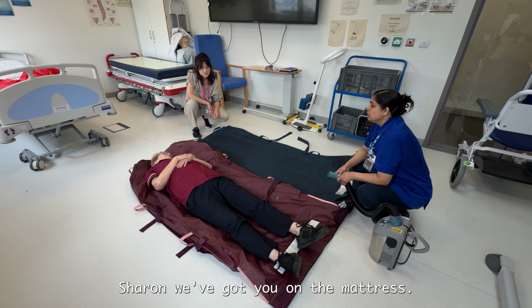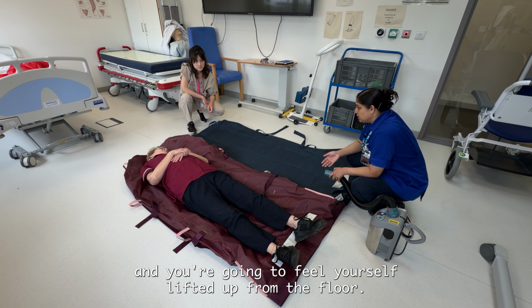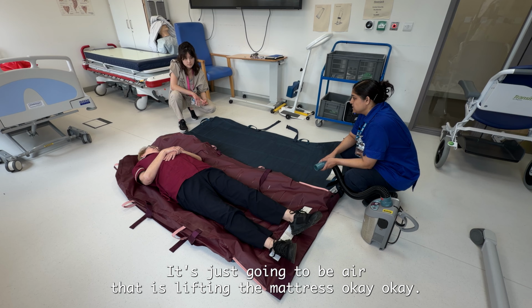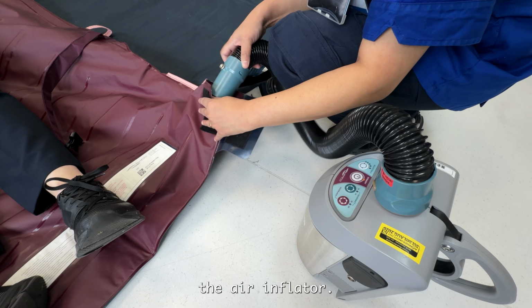Sharon, we've got you on the mattress. It's going to be a little bit noisy and you're going to feel yourself lifted up from the floor. Don't be scared of it. It's just going to be air that is lifting the mattress up. Okay? So I'm going to connect you to the air inflator.